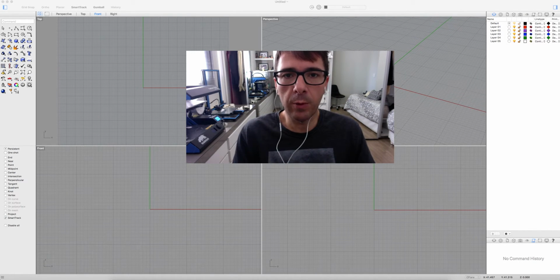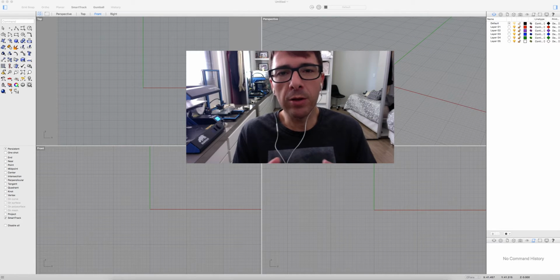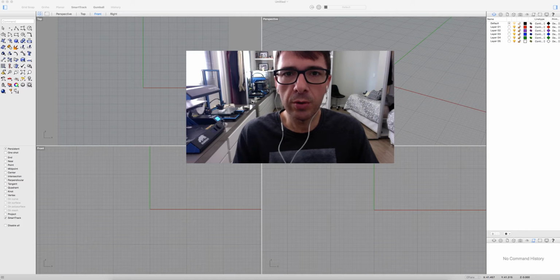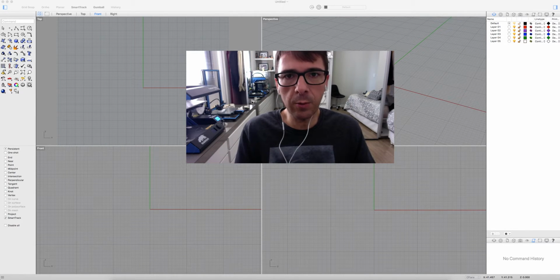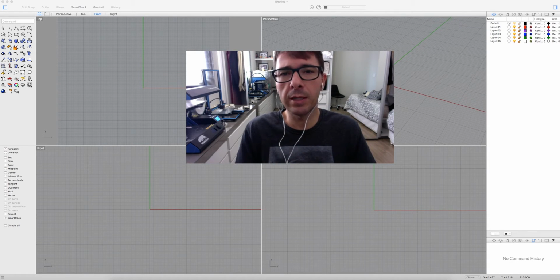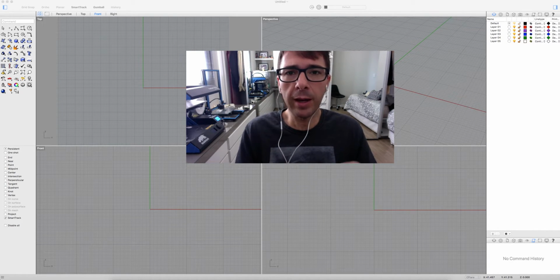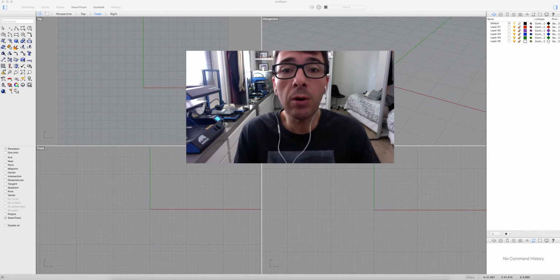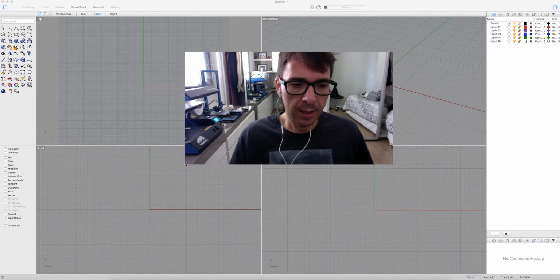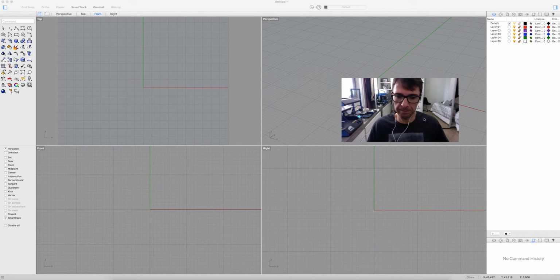We are using the Rhino software. The Rhino software uses solids as reference, so this is a beginner's way how to do that. There are easier ways using directly CAD softwares like Fusion. They are very accurate, but I'm going to show the visual way how we can create. So let's resize a little bit here.